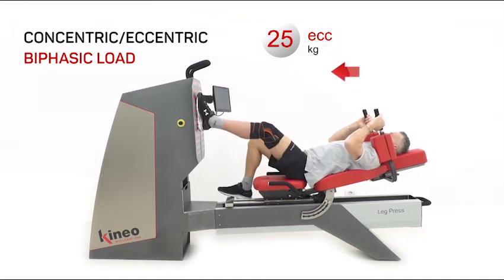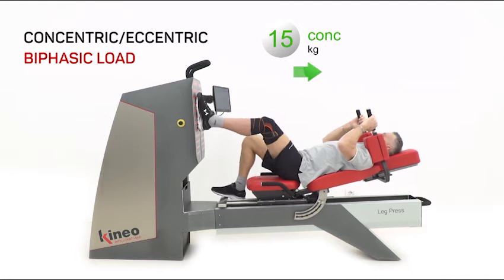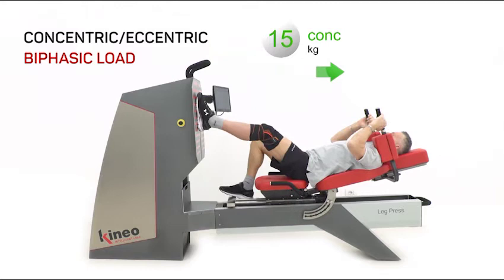With Kineo Leg Press, we can set up different loads in concentric and eccentric phase — for example, 15kg in the concentric phase and 25kg in the eccentric phase.